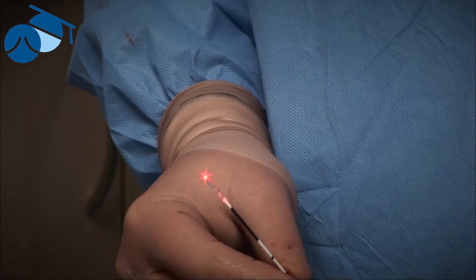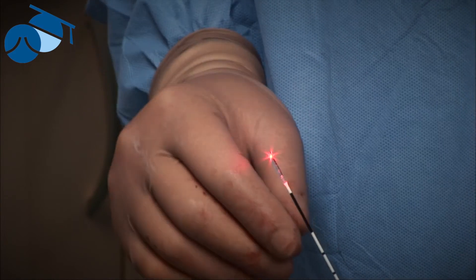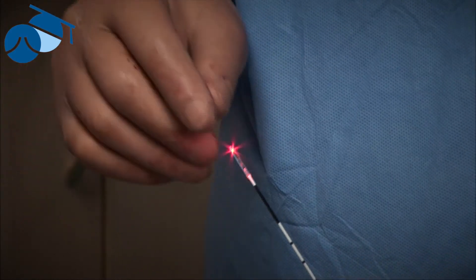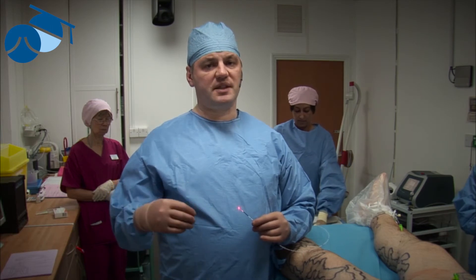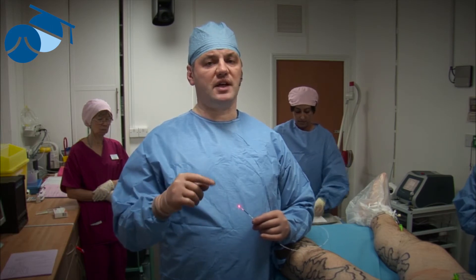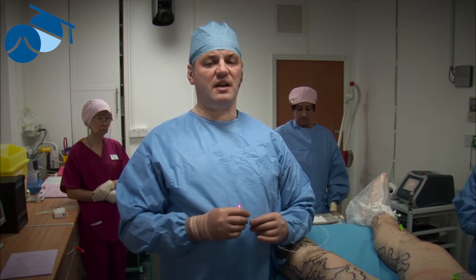This is an endovenous device that we quite like using. The original endovenous devices used to pass the energy out of the end of the laser, which used to cause either the blood to boil, causing superheated steam, or direct contact with some of the internal cells — but further down the vein, one to two centimetres away from the end of the laser. That makes it quite inaccurate, and we really didn't like that.